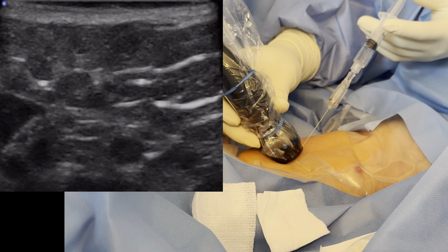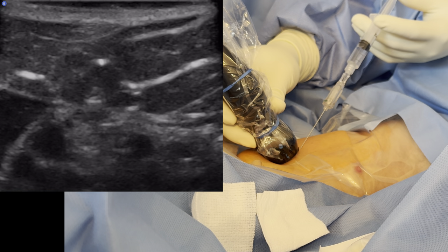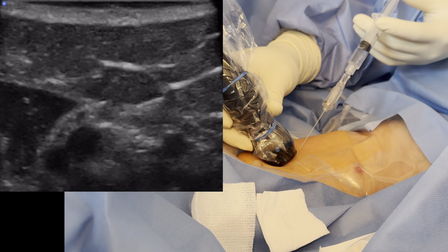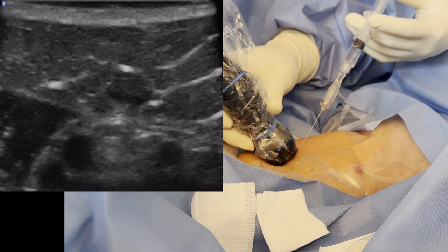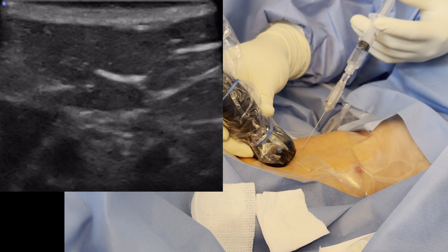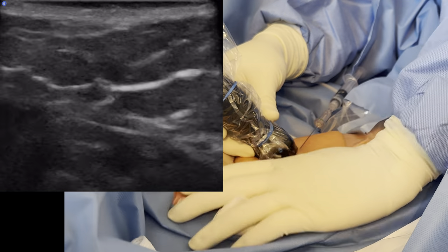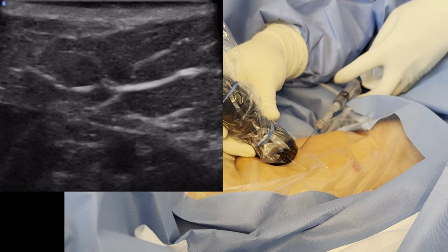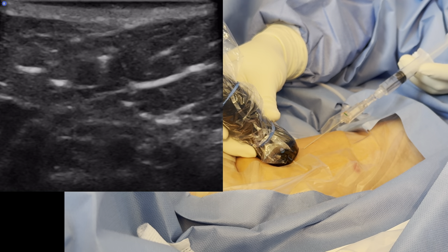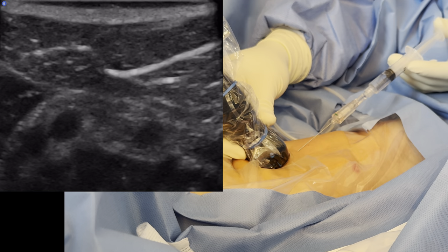Any pain? I'm going to go at a little bit of a steeper angle. I'm tilting it even more to be able to see — and I hope you're able to see how much I'm actually tilting. That's the key. A lot of people miss this part. This is why I don't use needle guides — because you cannot use this dynamic tilting technique to visualize that needle tip better.